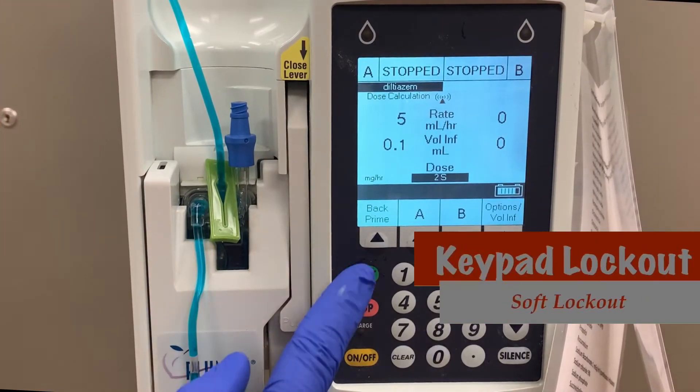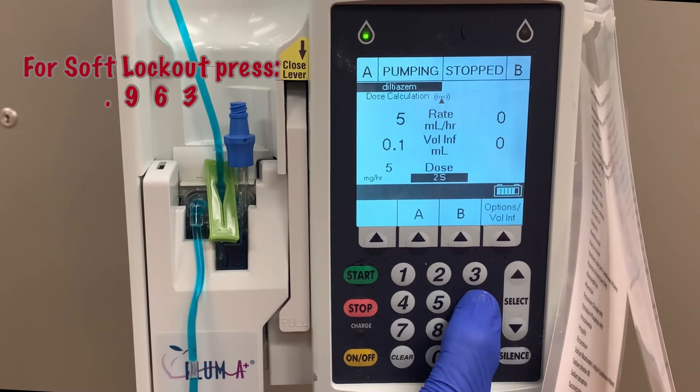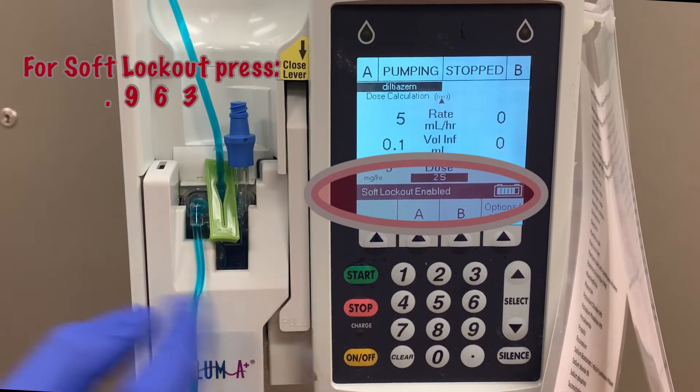The next type of keypad lockout is known as the soft lockout. It utilizes a universal passcode in order to activate and deactivate the lockout. To enable the soft lockout, in sequence, press decimal point 963. Soft lockout enabled will display on the screen.